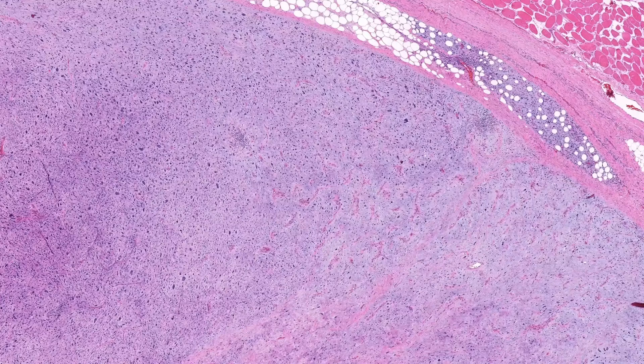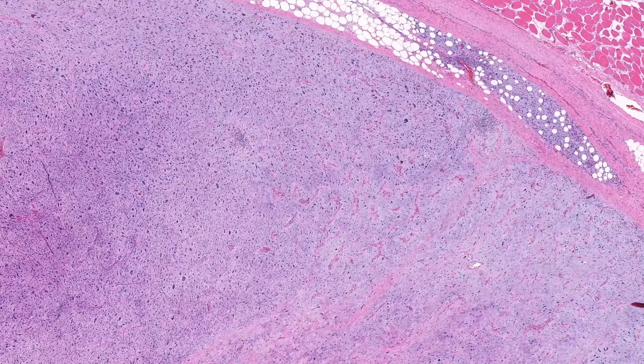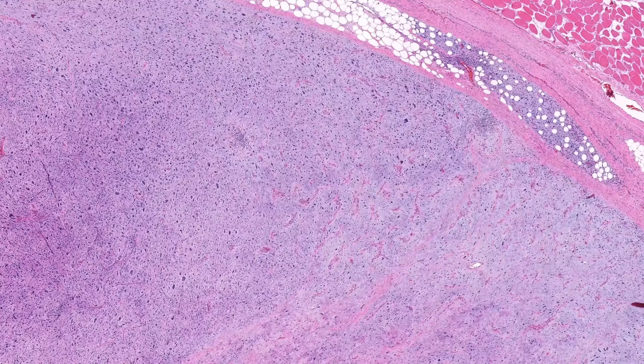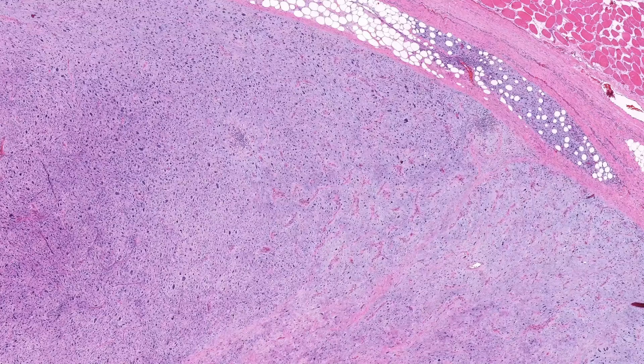Rarely, homologous differentiation can occur with areas resembling pleomorphic liposarcoma. However, dedifferentiation is not always high-grade with marked atypia, hypercellularity, and brisk mitotic activity. Some cases of dedifferentiated liposarcoma are deceptively bland, with relatively uniform spindle cells in a fascicular storiform or whirling pattern. Low-grade dedifferentiated liposarcoma may resemble a low-grade spindle cell neoplasm, such as low-grade fibromyxoid sarcoma or even fibromatosis.